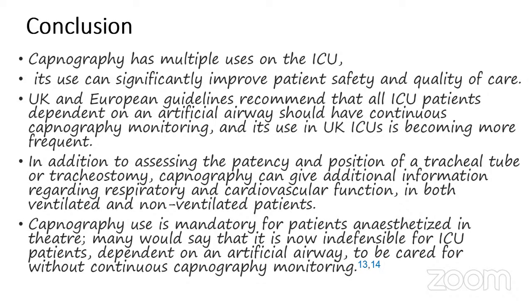To conclude, capnography has multiple uses in the ICU, not only in monitoring patency and respiration. It also significantly improves safety and quality of care. Some countries recommend using it for all ICU patients with an artificial airway, either invasive or non-invasive.